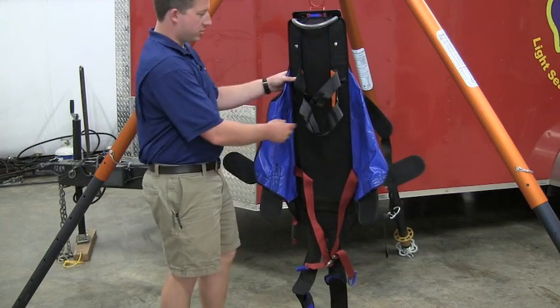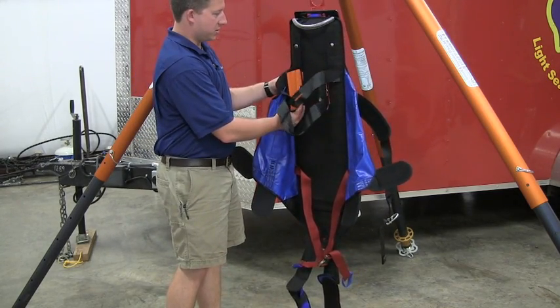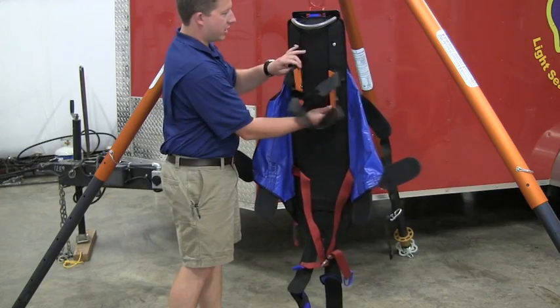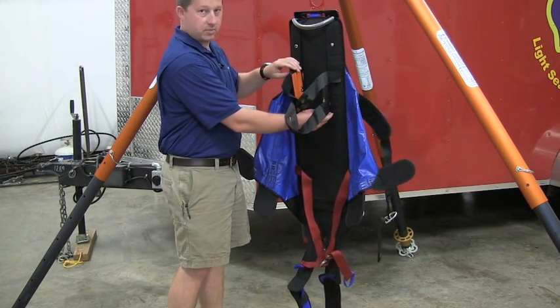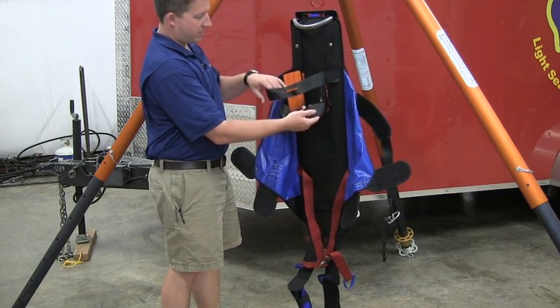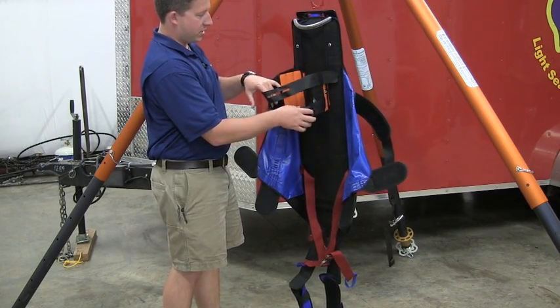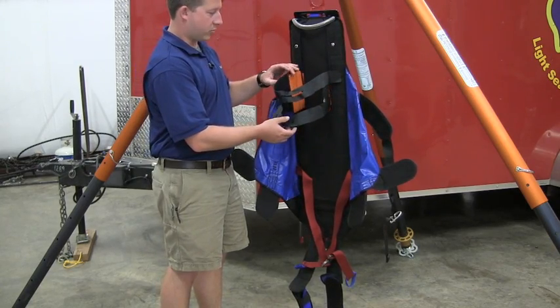Right below that, you'll notice the C-collar assembly, or the head immobilization section of this device, will actually slide up and down within the Spec Pak, so you can adjust it based on the size of the patient. It comes with a head strap and a chin strap to stabilize the head. These are the same, so you can't get them mixed up. It doesn't matter which one you use, top or bottom.